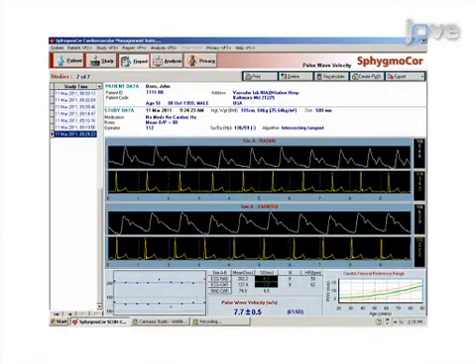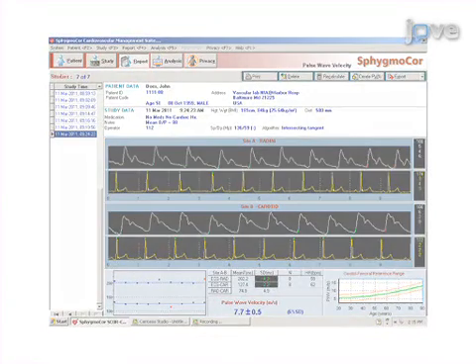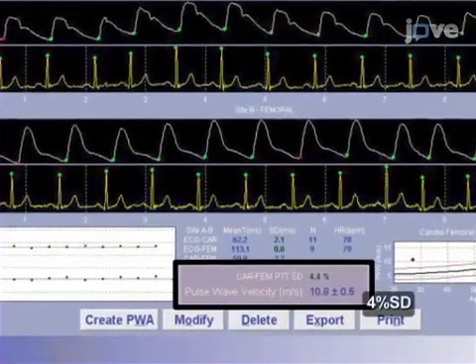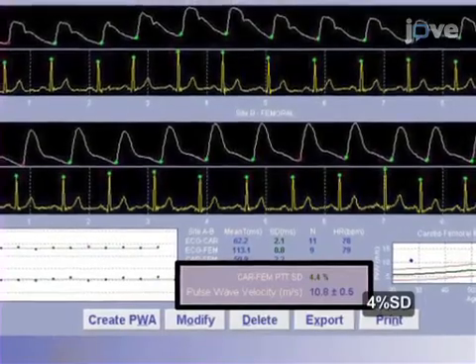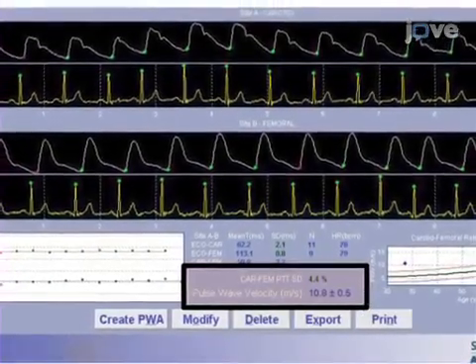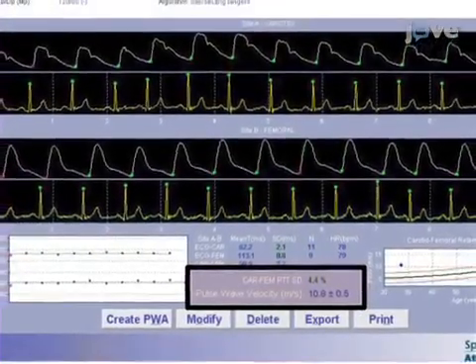Finally, custom-designed computer software analyzes the speed with which the pressure waves travel through the aorta. Ultimately, the speed with which a pressure wave travels through the aorta can be used to demonstrate the degree of arterial stiffening.